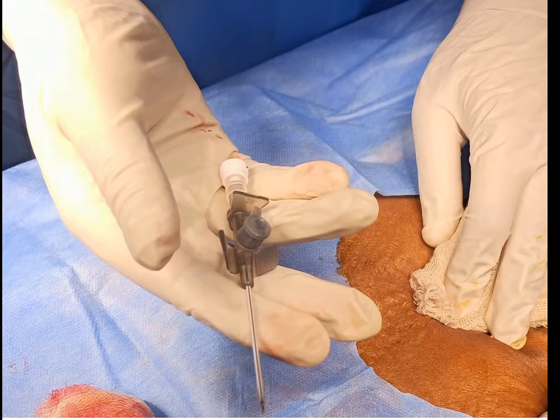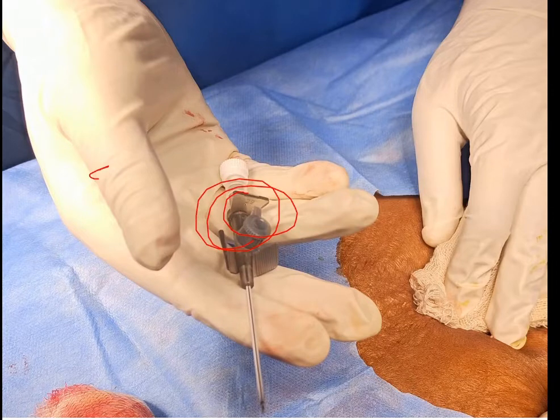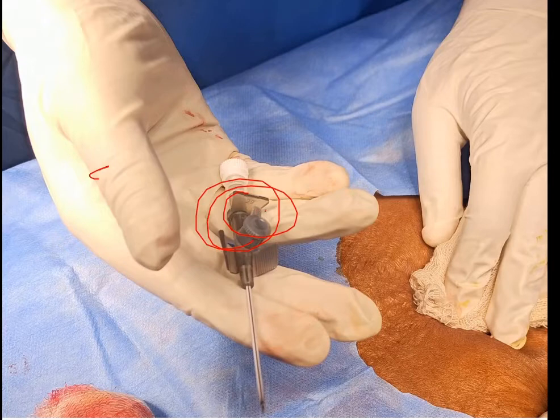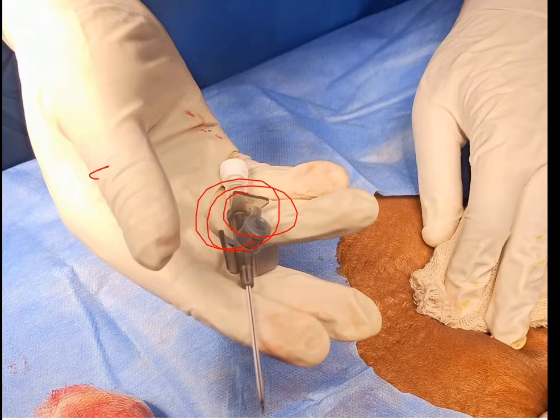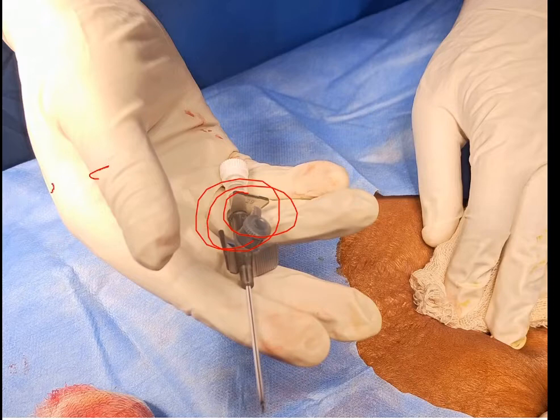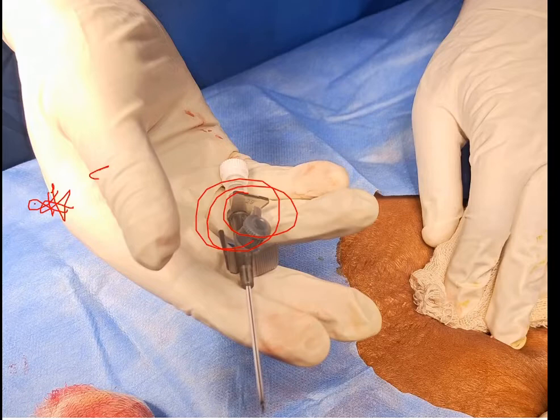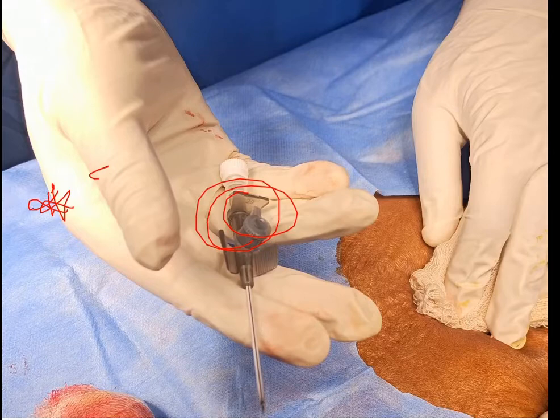This is where the role of the gray cannula comes in. The gray cannula is used instead of the introducer needle that came in the PD set, to avoid any bowel damage that can occur with the stiff introducer needle. We use this as the introducer to pierce through the rectus sheath and reach the peritoneal space, then remove the needle so only the soft part remains inside, reducing the chance of bowel damage. Is it compulsory? No — the introducer needle can also be used, but the gray cannula is preferred because the guide wire passes more easily through it.